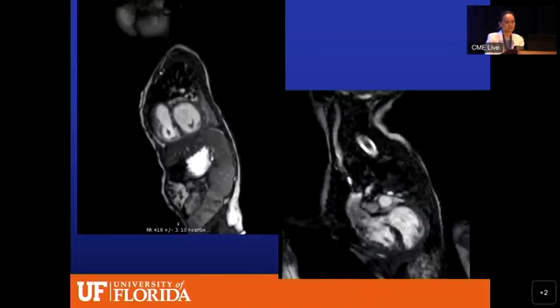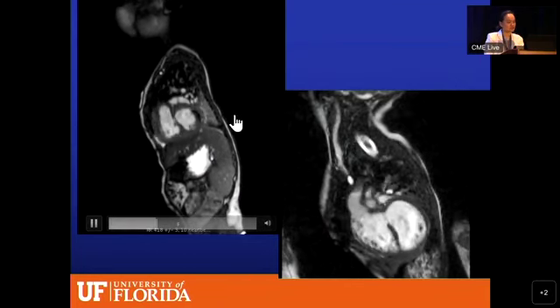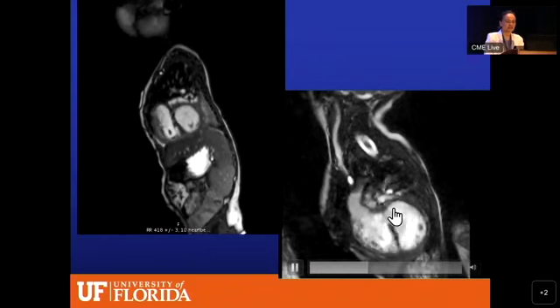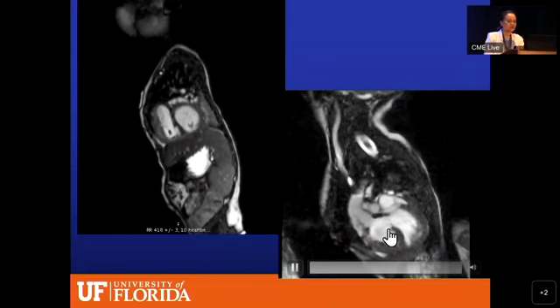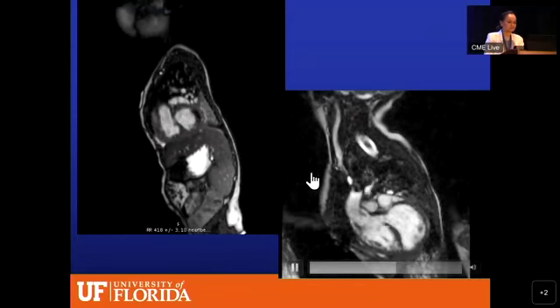hard to septate. This is just one of our patients, and you could determine function, especially right ventricular function. You could quantify, and again, you could see, especially in malposed great arteries and double outlet right ventricle, if the surgeon could baffle the left ventricle to the aorta.